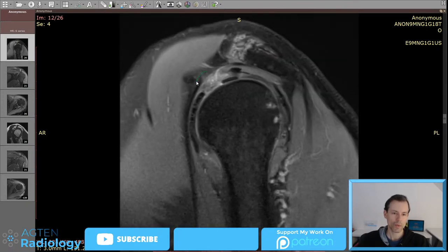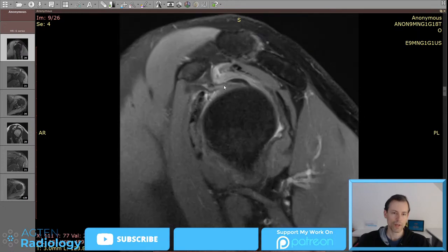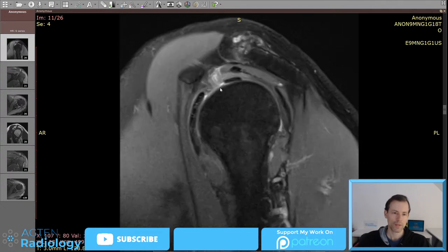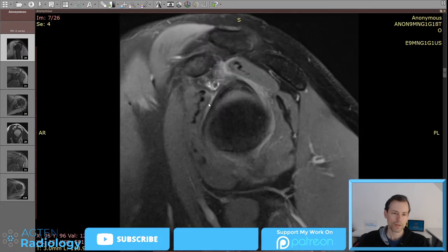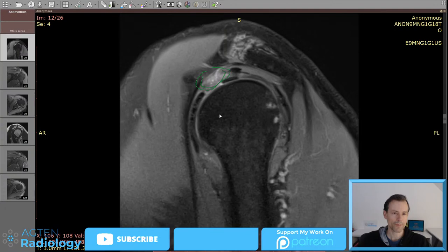Something we realize now is there is edema here. You probably saw that already earlier. And this is not in the supraspinatus muscle. So the muscle goes here, probably, and it's all going all the way down here. And that's one thing. And the other thing, but let me just continue with the template here first quickly.